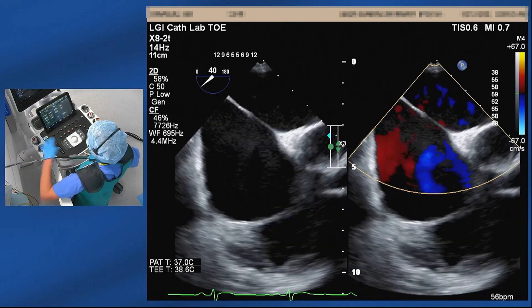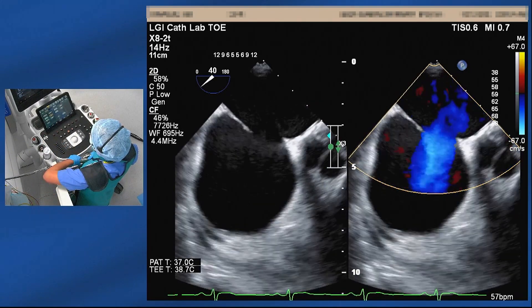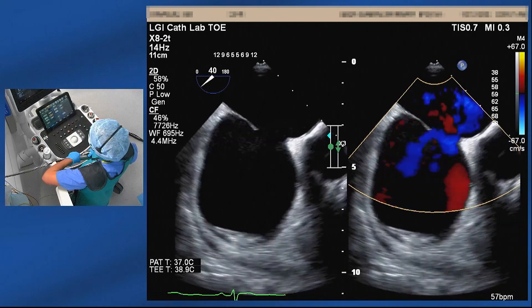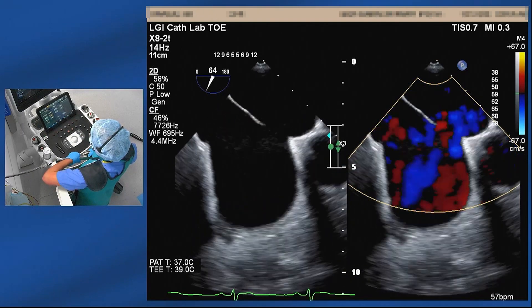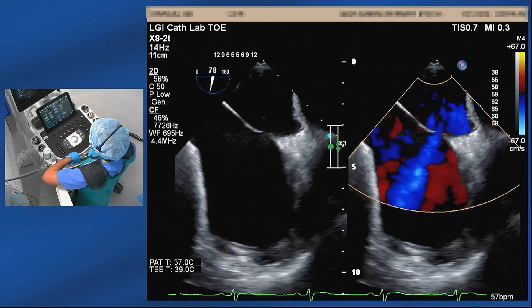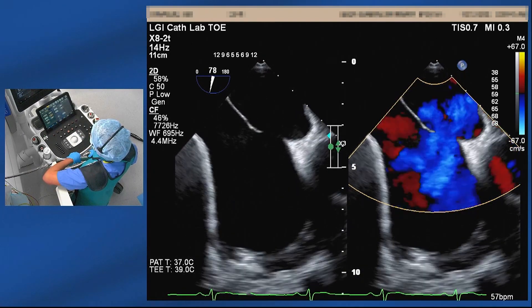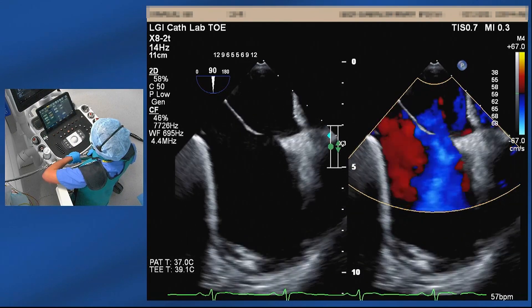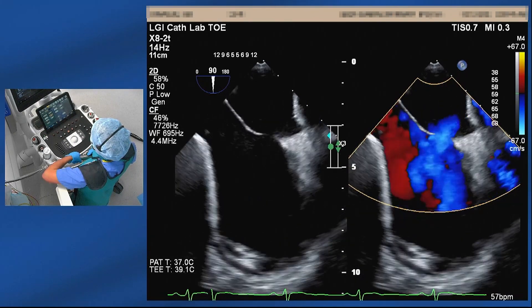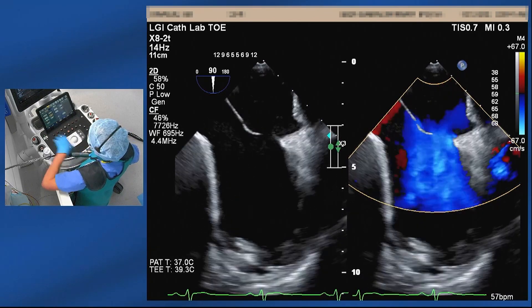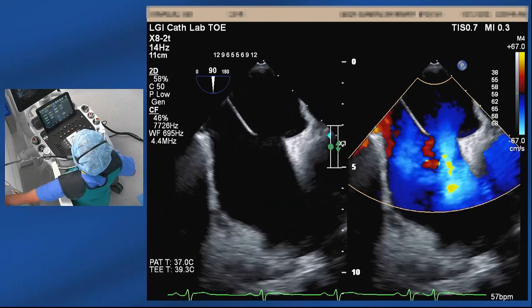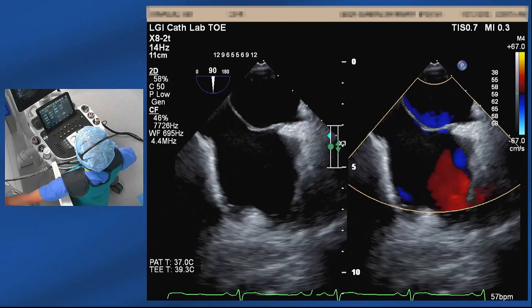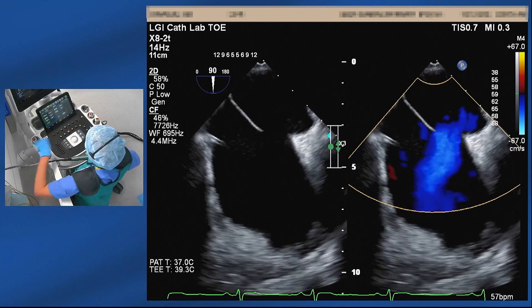At 30 degrees, we start seeing the aortic rim — there's a few millimeters. We continue to assess down to the superior-inferior rims: slightly thin inferior rim, but a good length of tissue, and then the superior rim is pretty good.